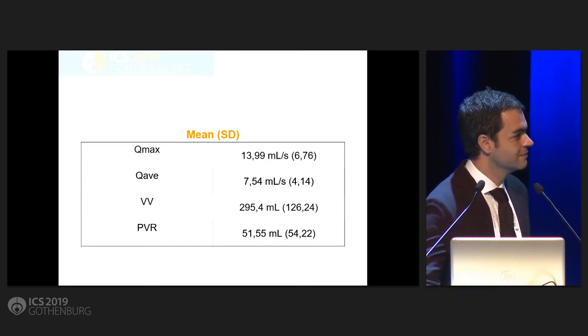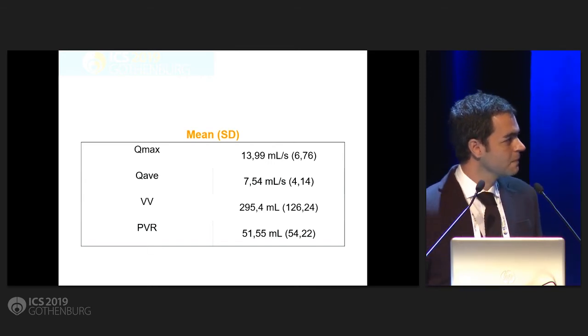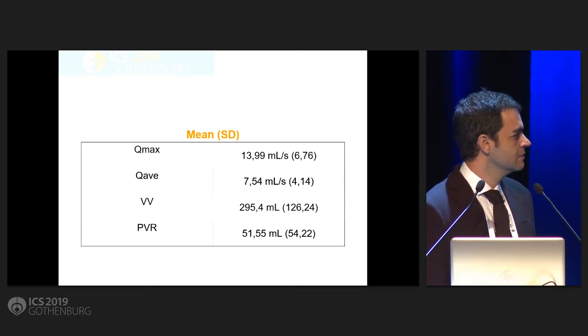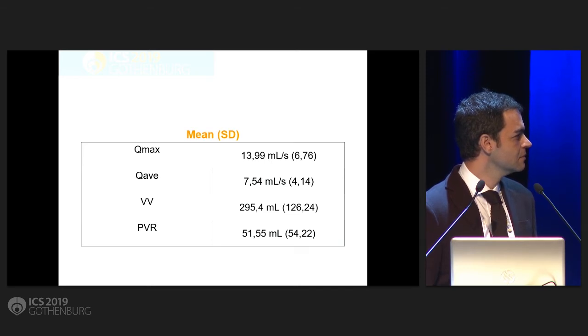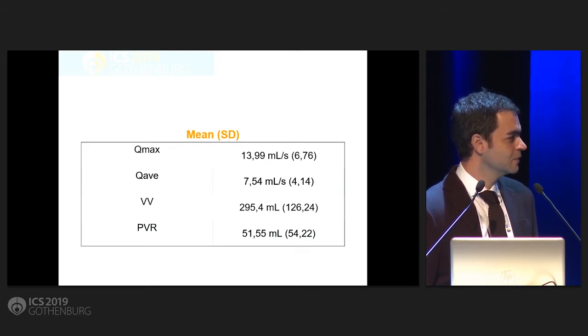Yes, I have a comment on this because I think that there is always the patient subjective fallacy that will be there, because many of our patients, for example, when you ask them about the stream, how it looks like, say, I'm very good, I'm normal. And when you put him on the uroflowmetry, it is really obstructed. So I think that the uroflowmetry is really different from this one. And there are definite subjective fallacies that will happen.